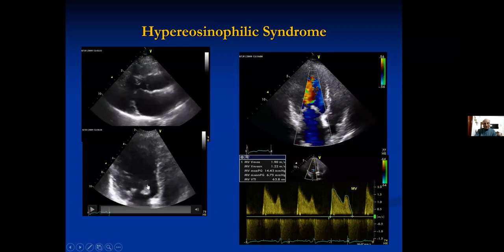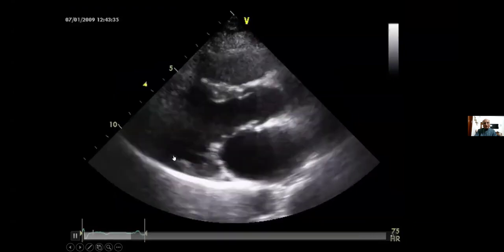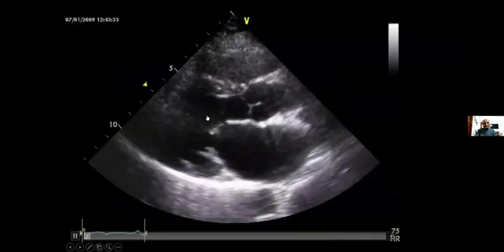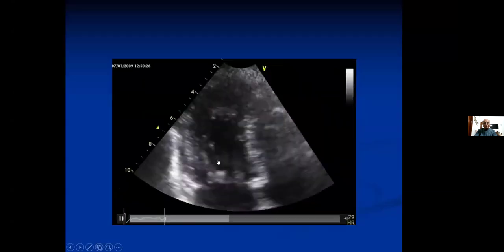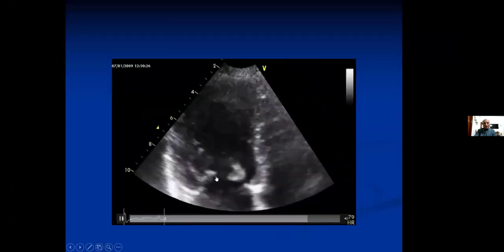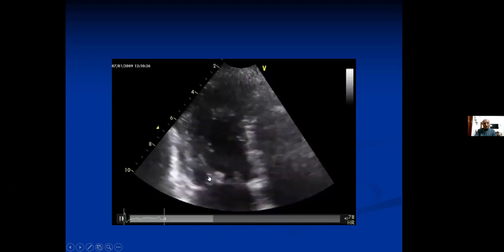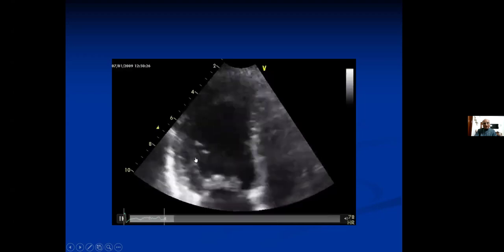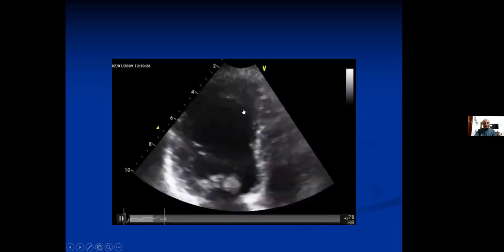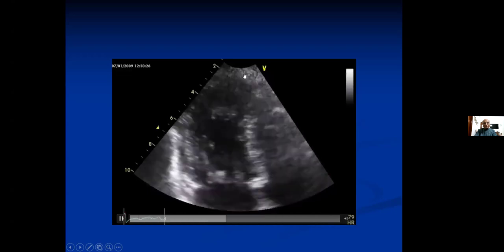hypereosinophilic syndrome. I will show you the next slide. You can see there is an inferior-basal endocardial thickening, besides, of course, doming. But the most important factor was that the zoomed apical view shows a marked fibrosis in the inflow region, very marked restriction of the movement of the posterior cusp, endomyocardial thickening and patchy fibrosis, and most important, the presence of an apical LV thrombus.